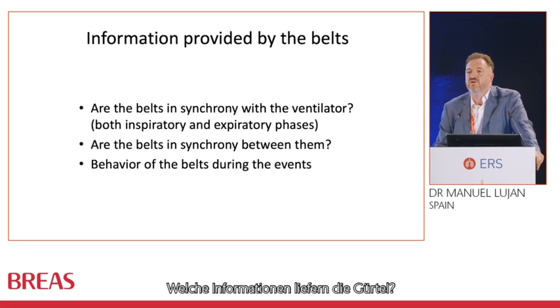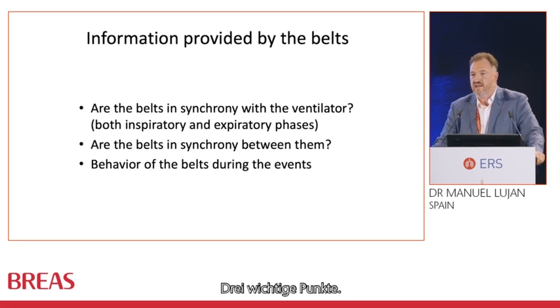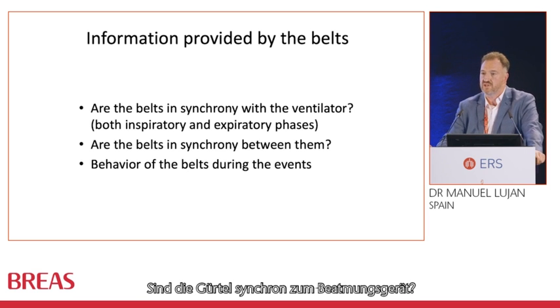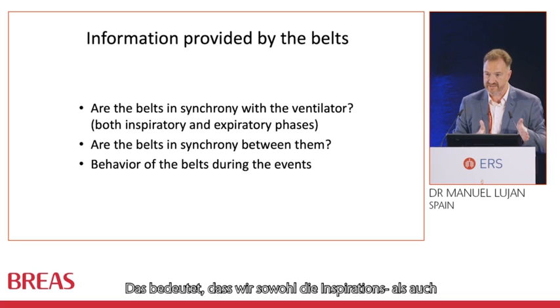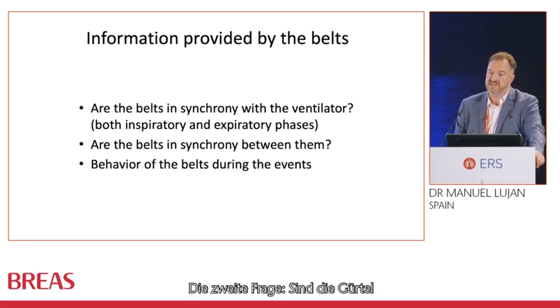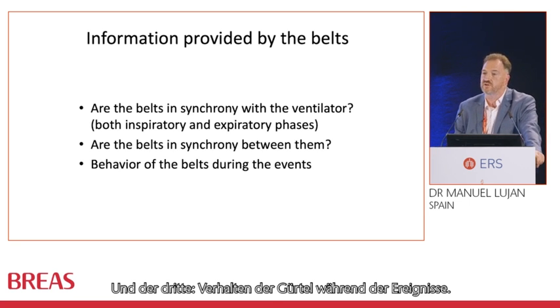What's the information provided by the belts? Three important points. The first one: are the belts in synchrony with the ventilator? That means that we need to read vertically, both inspiratory and expiratory phases. The second question: are the belts in synchrony between them? And the third one: behavior of the belts during the events.